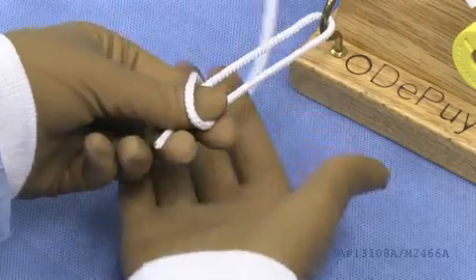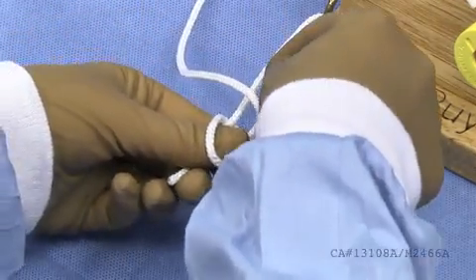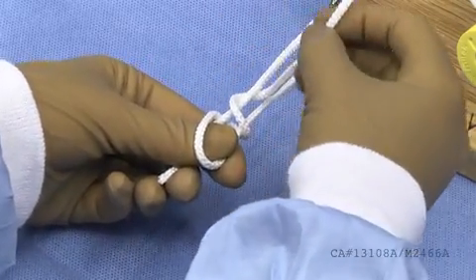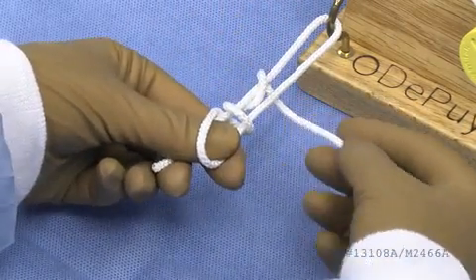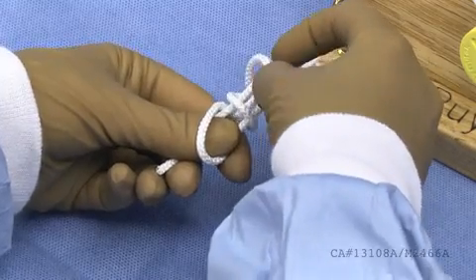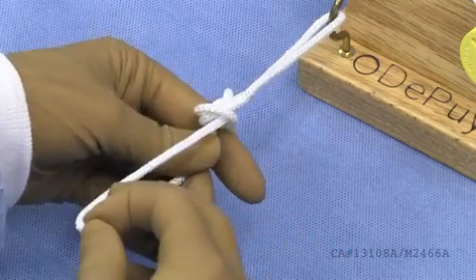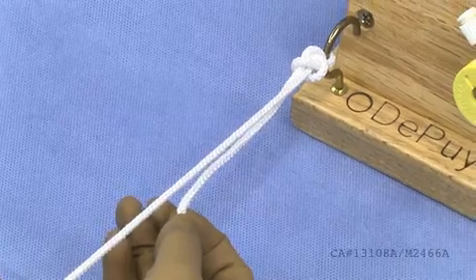After shortening your post strand, throw two overhand loops. Bring the suture up through the middle, distal to the second loop, and pass the suture over the left strand. Grab the suture from underneath both limbs and dunk it through the middle of the two overhand loops.